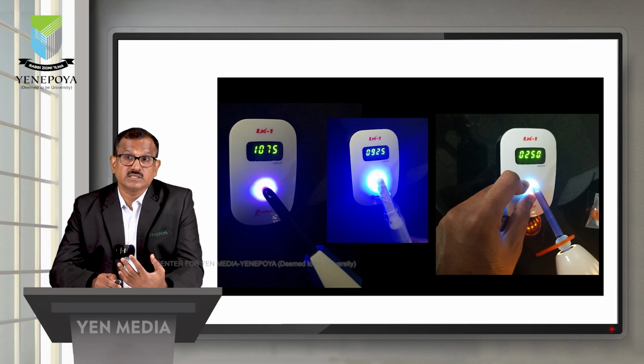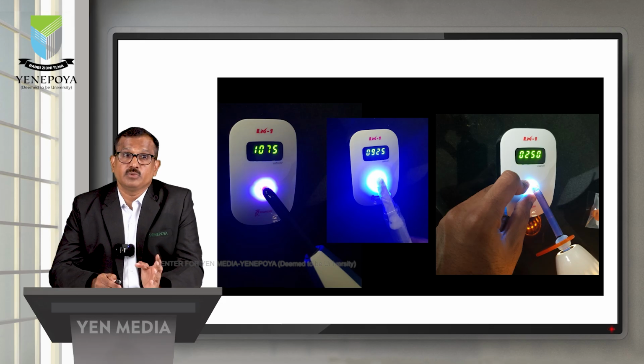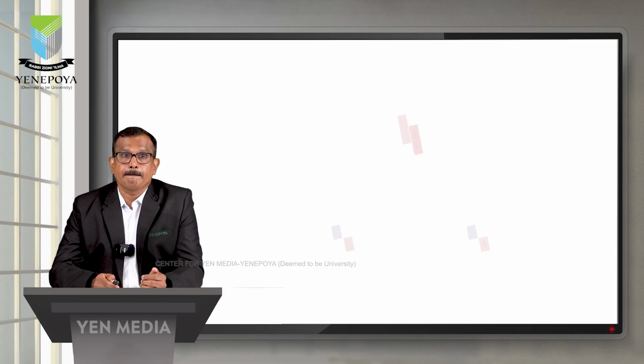That is where we should understand the intensity of the light is very, very important. So keep checking your light cure unit to make sure that you get somewhere between 900 to 1000, 1200, that range. Otherwise it is only light emitting, but it is not curing your composite restorations properly.